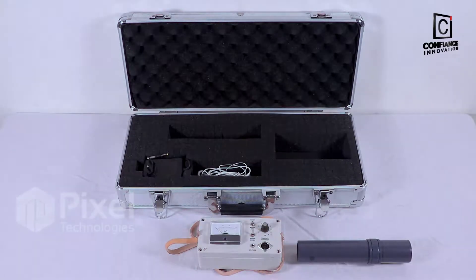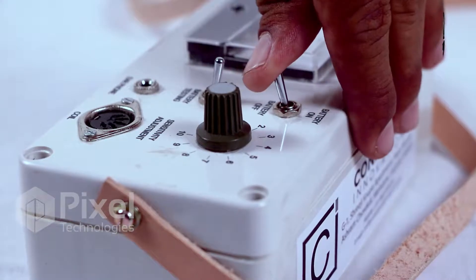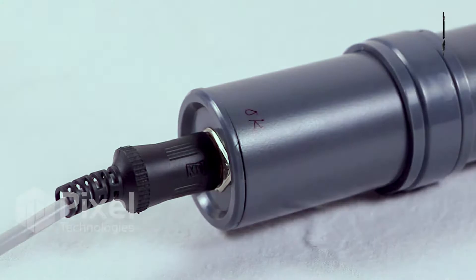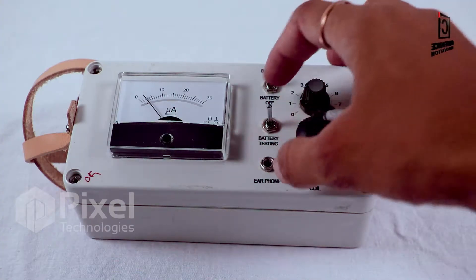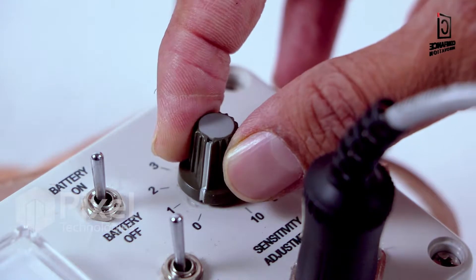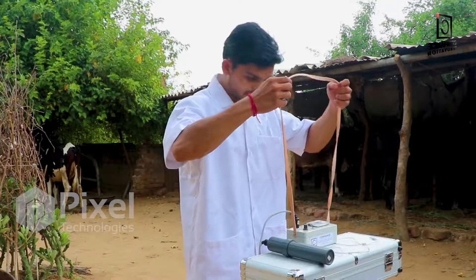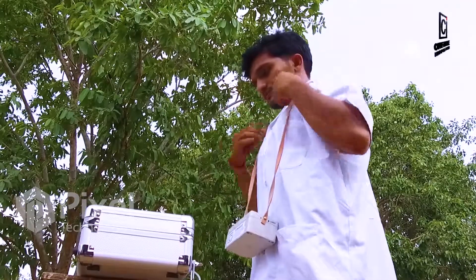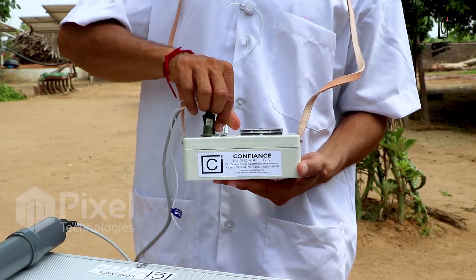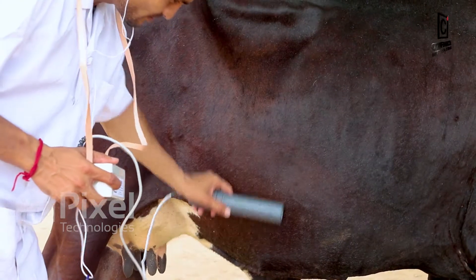To operate the veterinary metal detector: first, switch on the device and connect the probe to the main unit using the cable. Check the battery with the battery testing function. Then adjust the unit to zero scale for a low level of acoustic indication, and plug the headphone into the main unit.